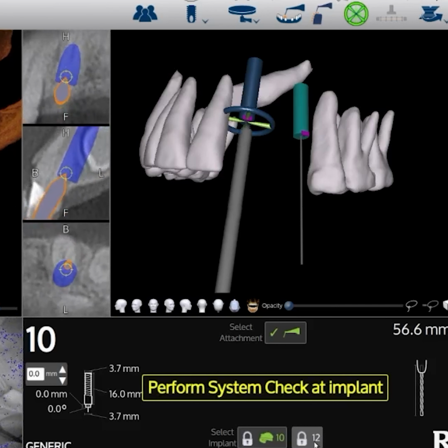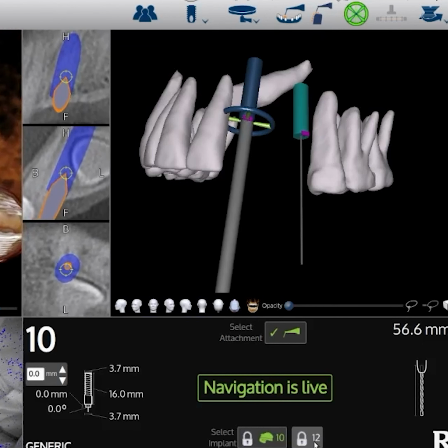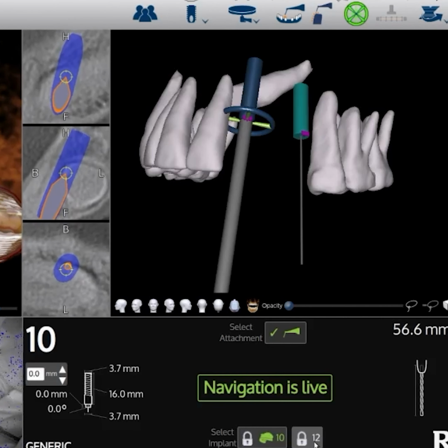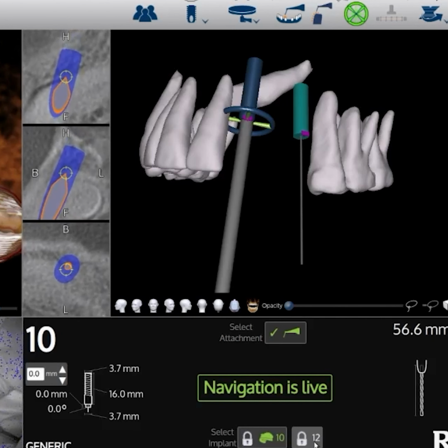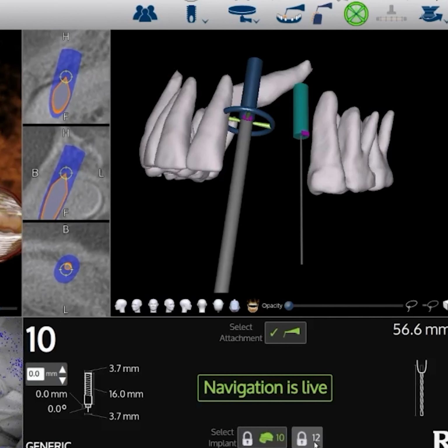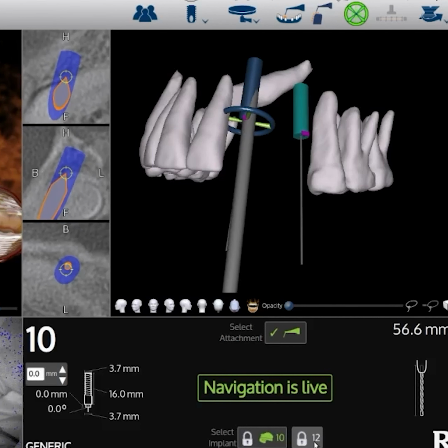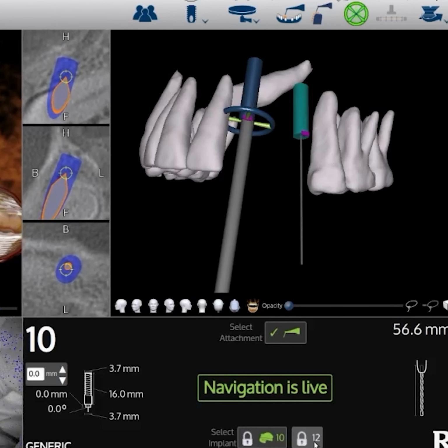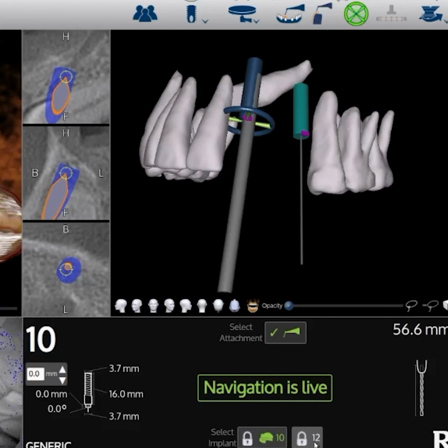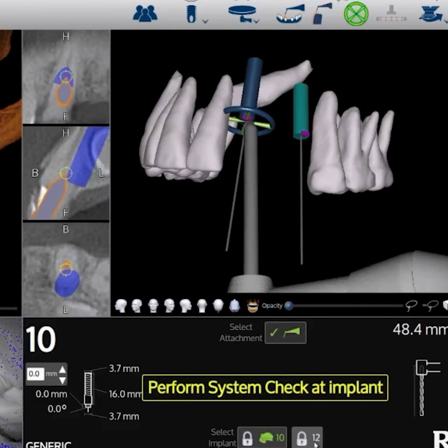And then you'll see here there's a segment of the surgery showing the dynamic navigation monitor as I'm creating my osteotomies, and notice how the drill bit is going in that transdental fashion, just as I had planned before the surgery on the patient's virtual treatment plan.